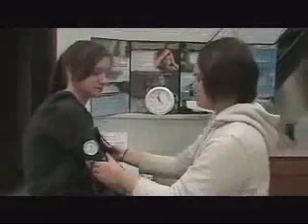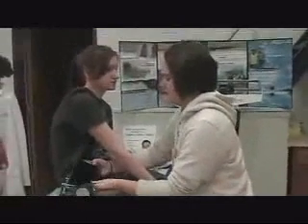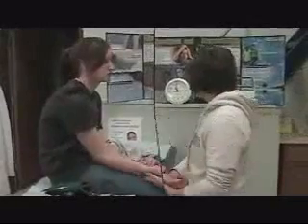Now we're going to do her regular pulse.